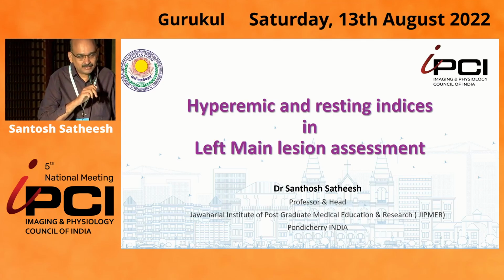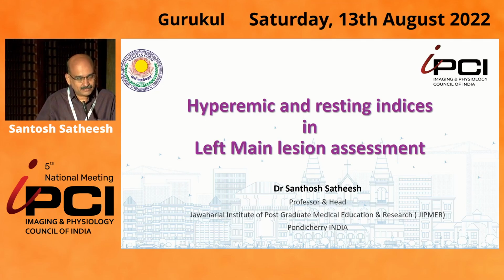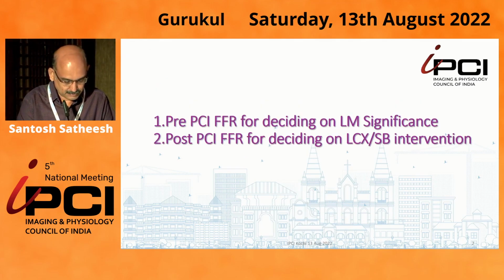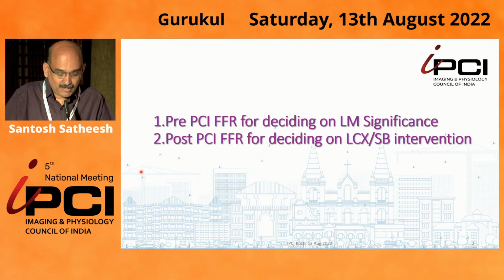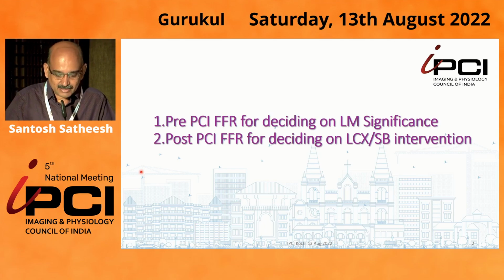Thank you. Over the next few minutes, I'll try to explain the use of FFR in left main. Specifically, I would like to focus on two things: the pre-PCI FFR for deciding on left main significance, and the post-PCI FFR for deciding on circumflex or side branch intervention.